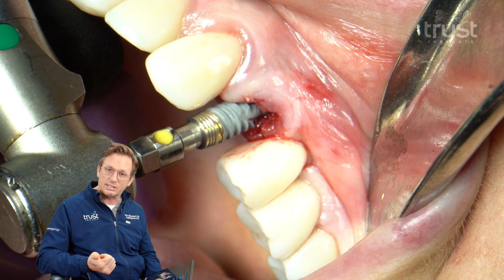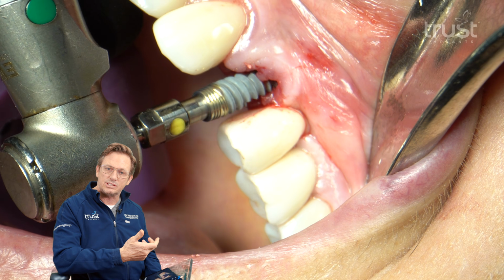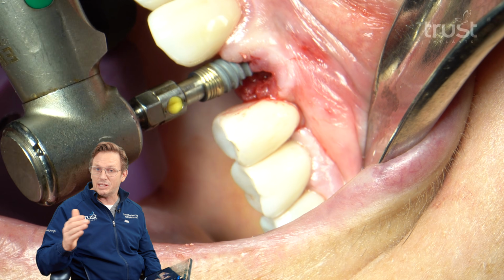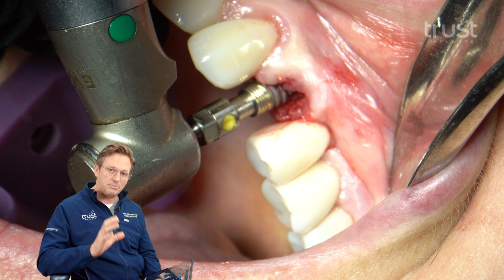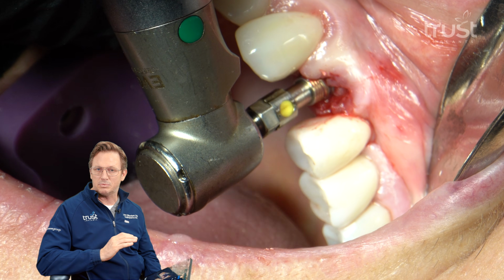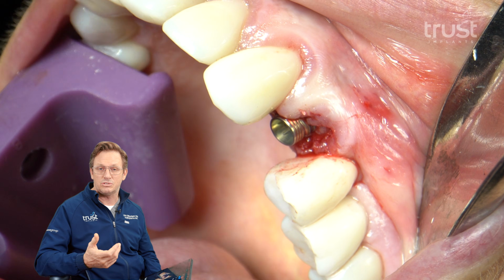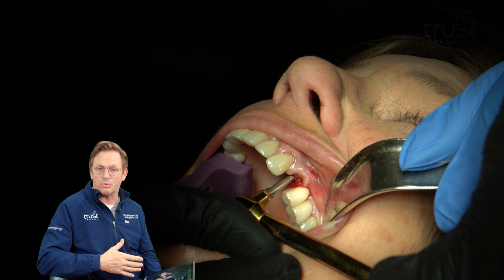So we've extracted the tooth, prepared the osteotomy, grafted the extraction site, and now we're placing our implant. You'll notice here that I'm getting 50 plus Newton centimeters of torque on this implant, so I'm completely fine to load the implant right away.